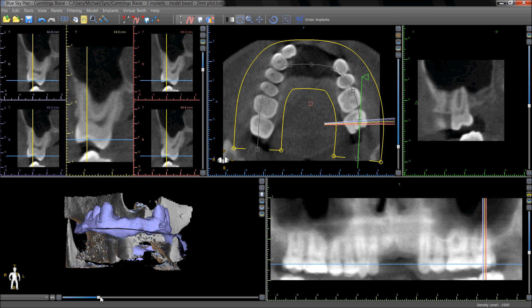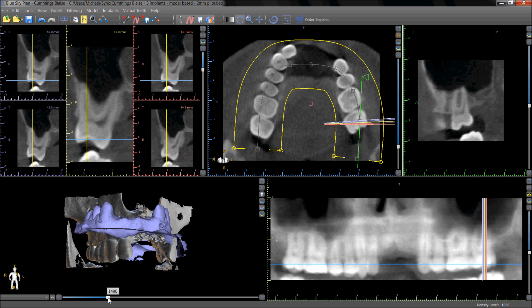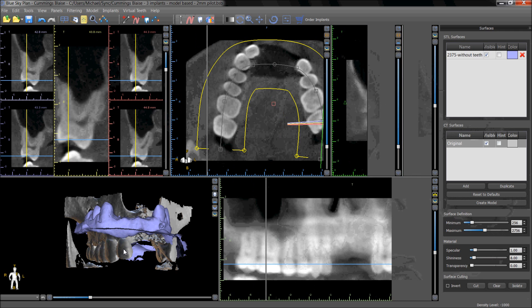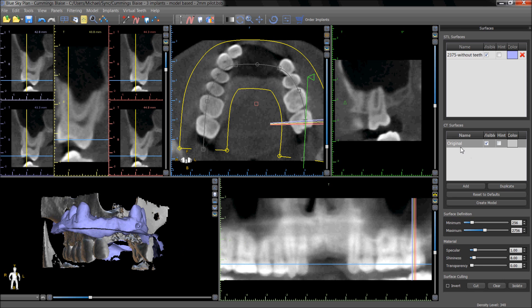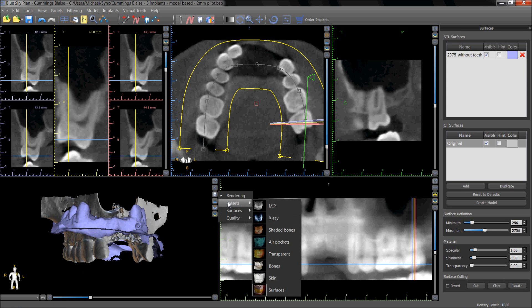Before aligning an imported model, it is a good idea to raise the density threshold of the CT scan to make the teeth clearly identifiable. Via the surfaces panel, the relevant area can be isolated by choosing isolate and then clicking on the relevant area of the CT scan. All other parts of the CT scan will disappear. It is also important to make sure that you are in the surfaces volume rendering mode.